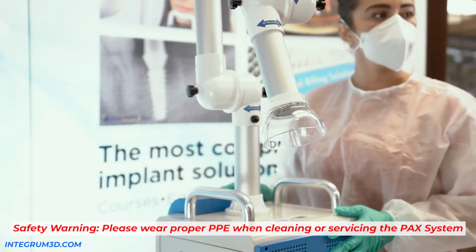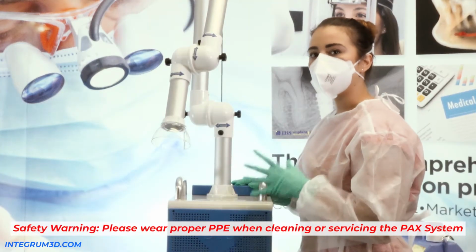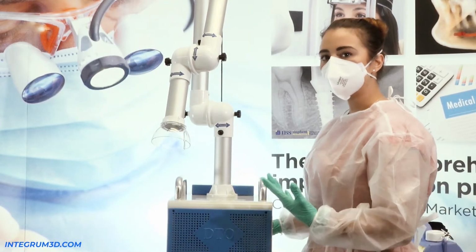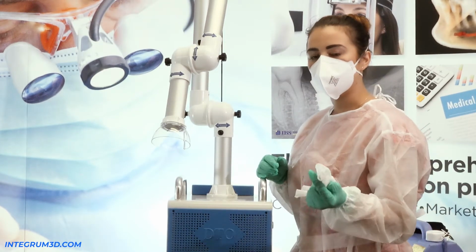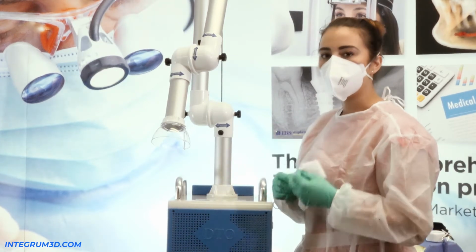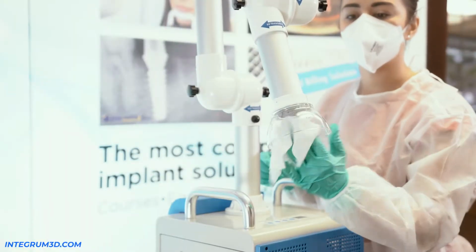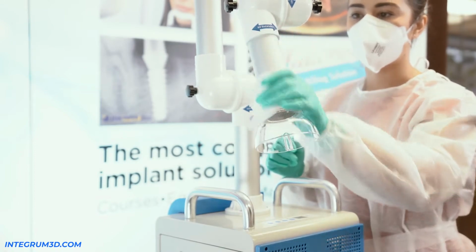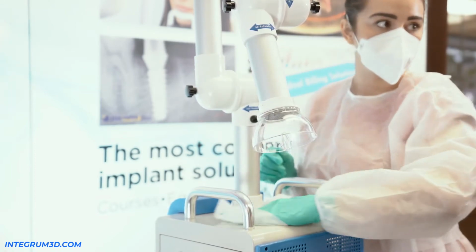When you're done using the machine on your patient, it's important to leave the suction running for 5 minutes. After doing so, grab any disinfectant wipe that you may use at your office, such as alcohol or cavi wipes, etc. Make sure you disinfect every part of your machine that you may have touched, including your control panel.